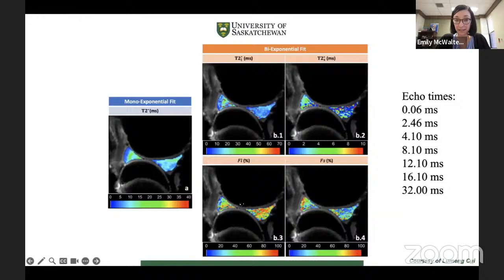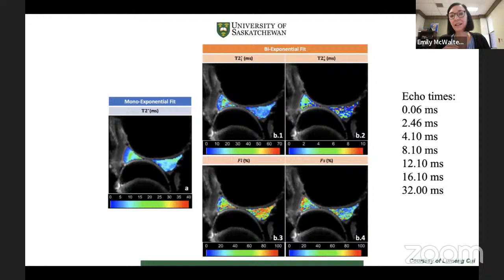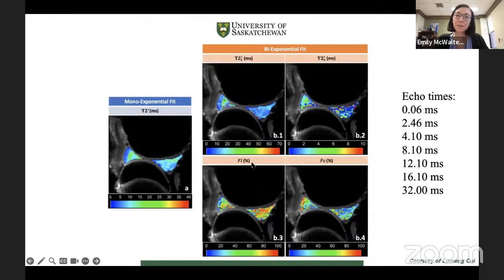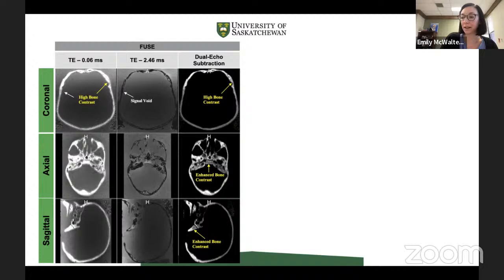We also do T2 star mapping. For the meniscus, we've done mono-exponential and bi-exponential fitting with a bunch of different echo times, and we're seeing really reasonable results. They're all a bit lower for the bovine than for human — the bovine meniscus T2 is a bit different. This is proof of concept that our FUSE sequence is working and we're able to do quantitative mapping with it.